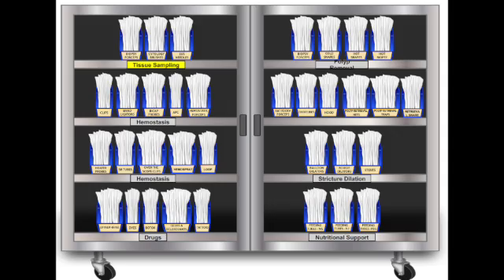Makes sense. Second. Closure. Closing holes. If there's a defect left after removing a large piece of tissue with EMR or ESD, you clip it shut. Or, crucially, if there's an accidental perforation, clips are the first line of defense to try and close it endoscopically. Life-saving closure. And the third function, you said it was complex.